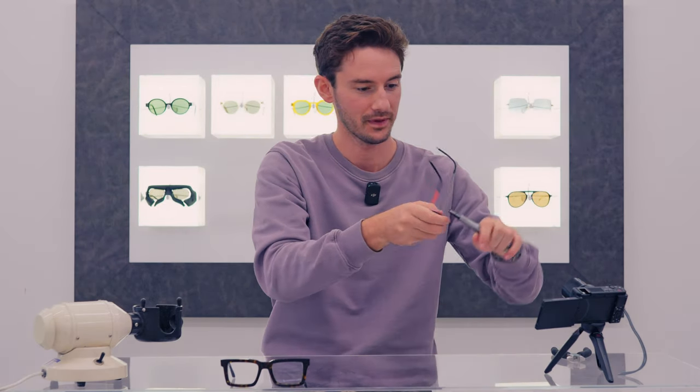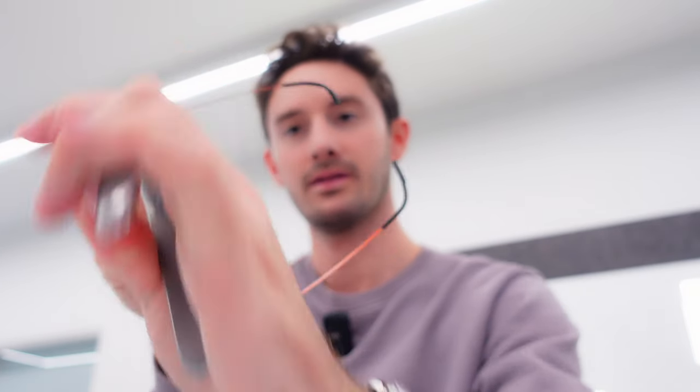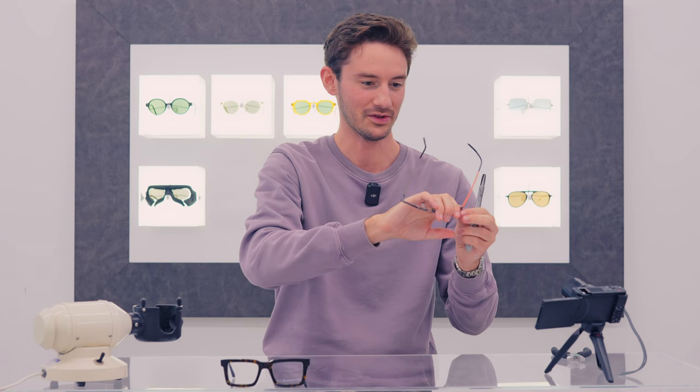With the steel nose pliers, we're just going to bring this temple inwards like so, and this temple outwards by the same amount. You'll see now that the right lens is going to be way further away from my eye than the left lens — an extreme example just to show you how much adjustment can be done.